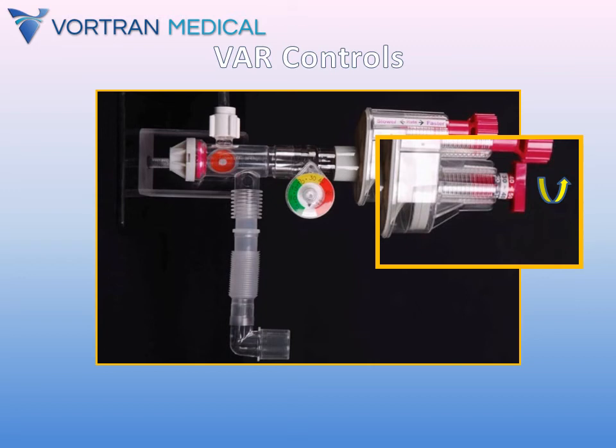The T-knob controls the peak inspiratory pressure, or PIP. The greater the pressure you set, the longer it will take your incoming liter flow to build up to that pressure, and the greater the tidal volume will be. As well, the converse is true. Hence, while the T-knob actually sets the peak inspiratory pressure, we call it the T-knob because it also controls our tidal volume.